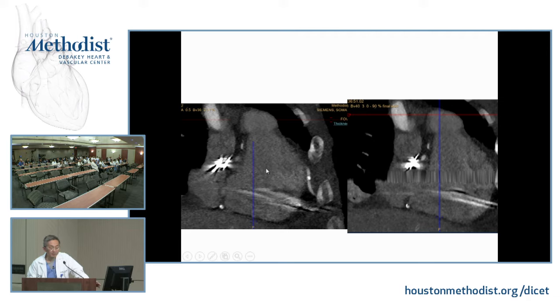This is the same set of images. This is the original raw images coming out of the scanner. This one was touched by the technician. He did something. What do you think here, this strip here? It looks even worse than the original, right? So usually this means there's loss of data, okay?